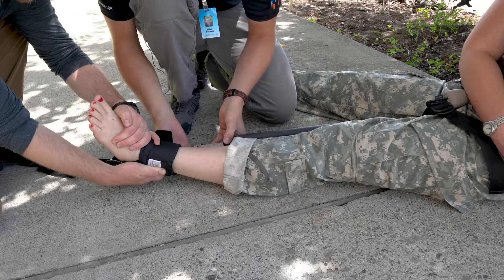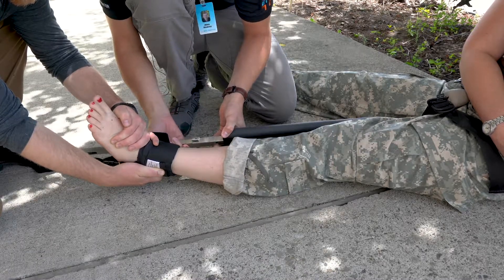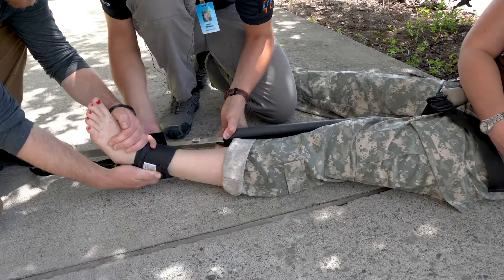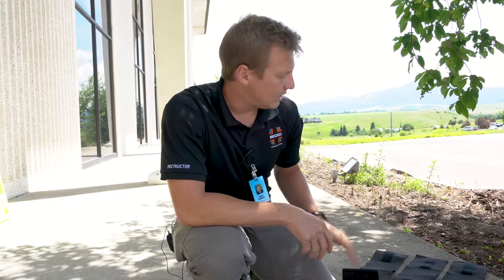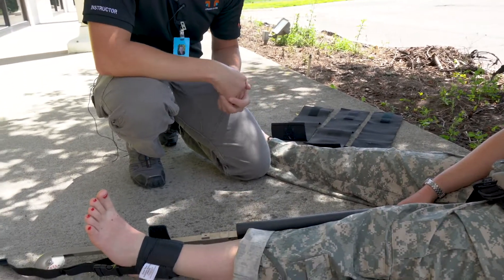I'm going to apply mechanical traction — let me know when my force equals yours. When the forces match, mechanical traction is set. When preparing your support straps, lay them out so that you're in the position you want them to be when you apply them, to avoid getting caught or tangled on the ground.